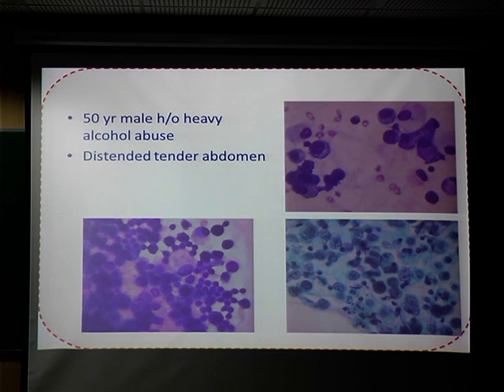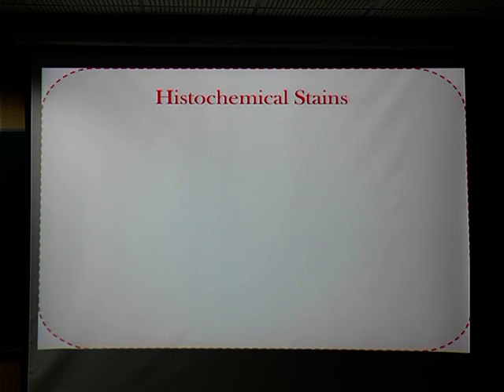So you don't know exactly what the source of these cells is, and whether this is a mesothelioma, or these are metastatic cells, or a second population of cells. Now before embarking on very costly immunocytochemistry and making cell blocks, you do have some histochemical stains which are very, very helpful, and these include mucicarmine, PAS stain, and Alcian blue. If used judiciously and with full understanding, you can really get some help.